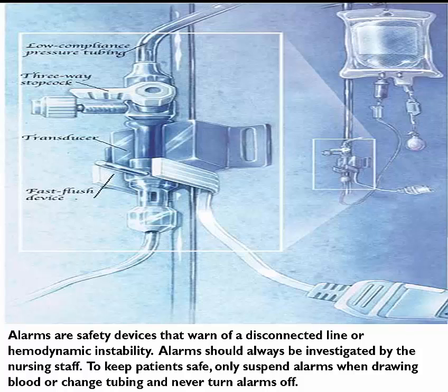Alarms are safety devices that warn of a disconnected line or hemodynamic instability. Alarms should always be investigated by the nursing staff. To keep patients safe, only suspend alarms when drawing blood or changing tubing, and never turn the alarms off.